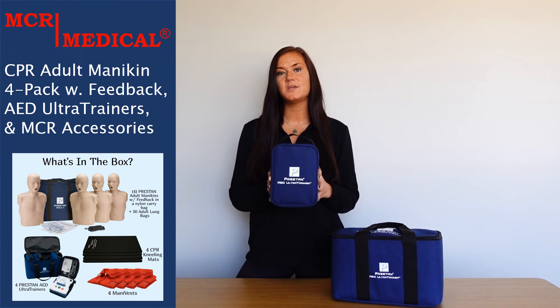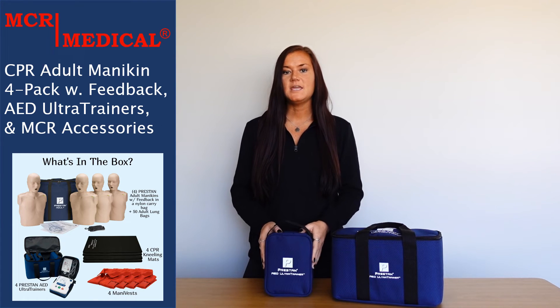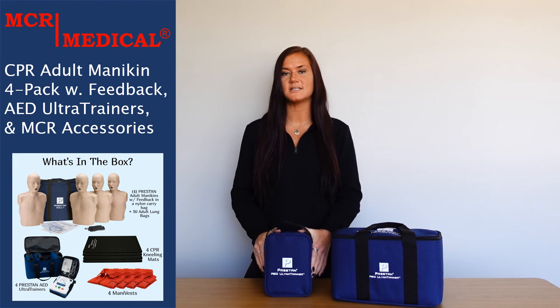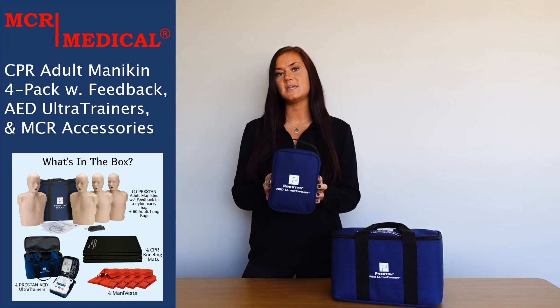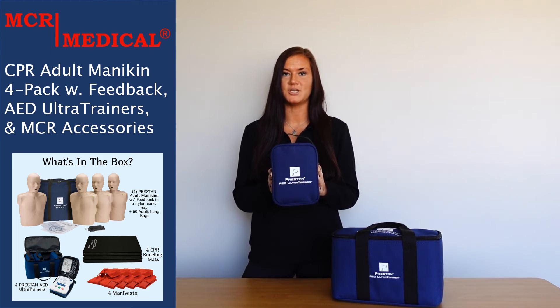Each unit requires three C batteries, which are not included. The AED trainers also come with a three-year manufacturer's warranty against defects and workmanship. Please note that these AED trainers are for training purposes only and cannot be used for patient defibrillation.